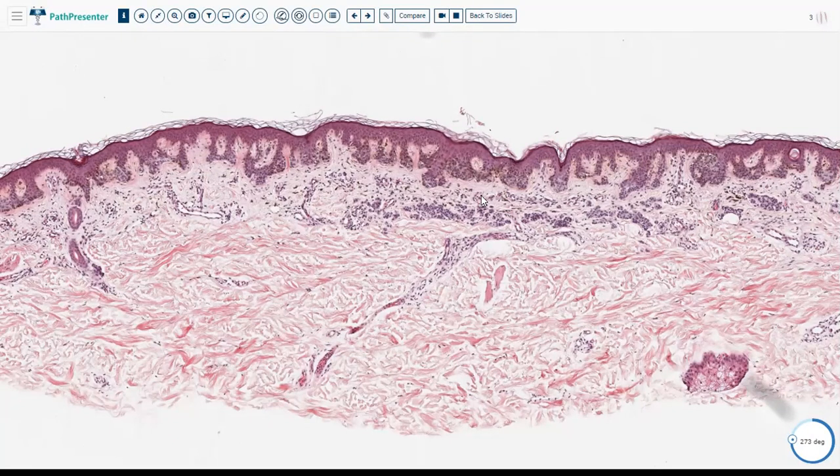And when I say it's a severely dysplastic nevus, it's me telling the clinician, very frankly, I really don't know if this is a nevus or a melanoma. I don't have enough criteria to say that this is a melanoma. But then again, I really can't say that this is a nevus, because it looks really abnormal on H&E or with stains. Moderate is usually midway between the two. It's when I really think it's a nevus, but I feel a little bit concerned, and I give the clinician the decision whether or not to remove it, with margins.